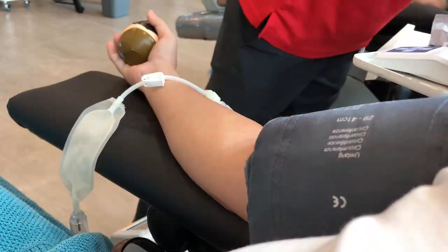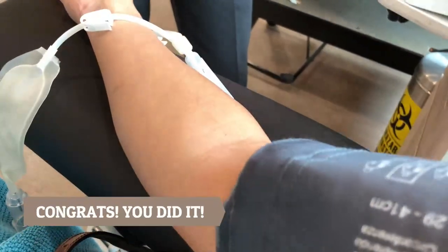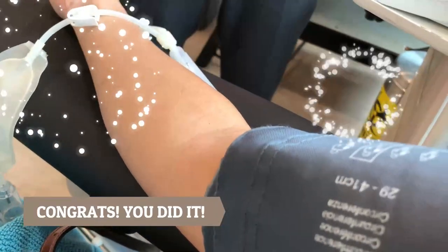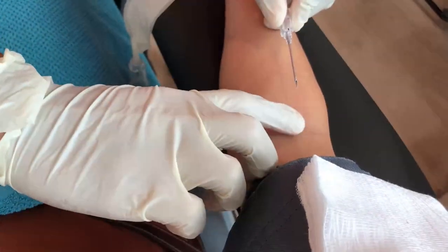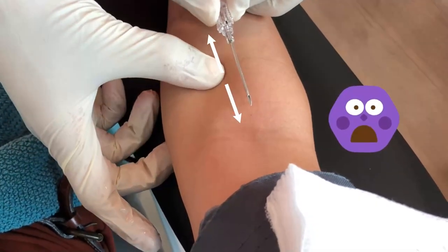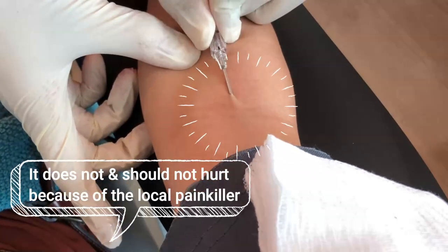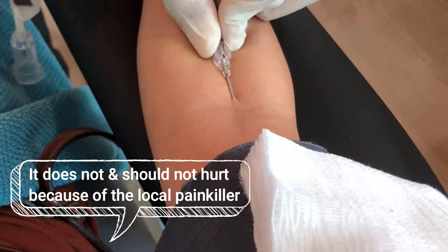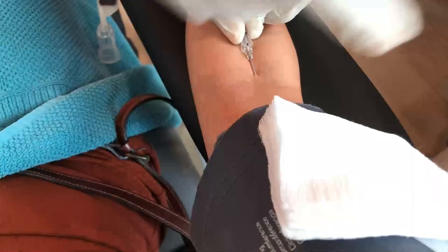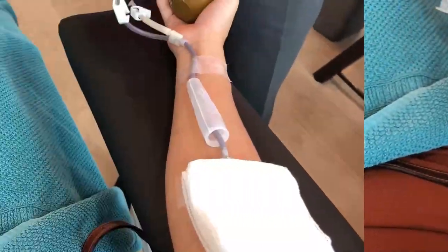That's about it guys — I think that pretty much wraps up our blood donation experience. You can see there's a little pin, he's covering up, you're good to go. Just kidding! This is the real needle for the donation. Yes, it is this big, it is this long, and the whole thing is going to go into your vein. But it does not hurt, because he basically put in local anesthesia right before this. Yeah, that didn't hurt at all. No pain. Nothing. I know it looks scary because it's huge, but it's not painful.